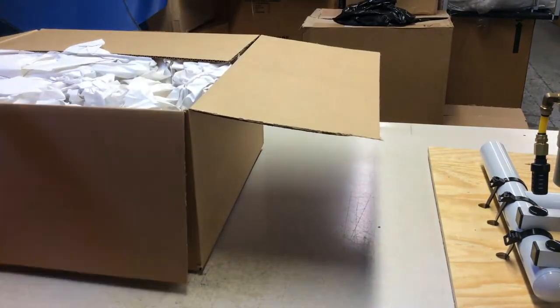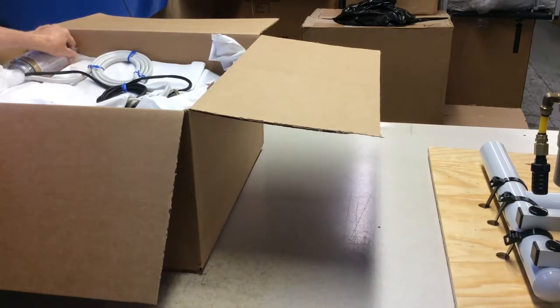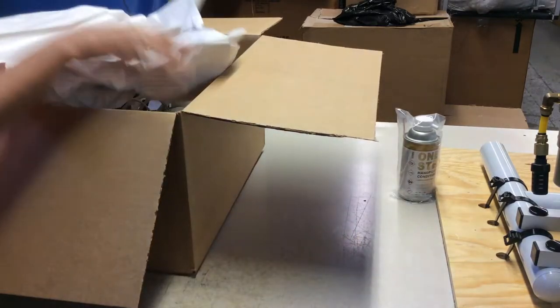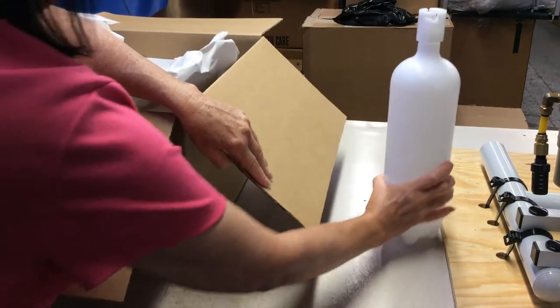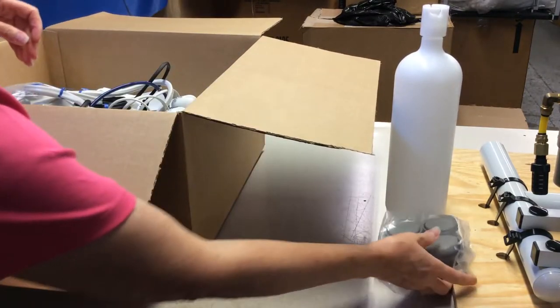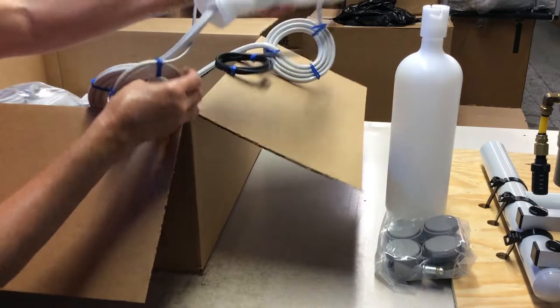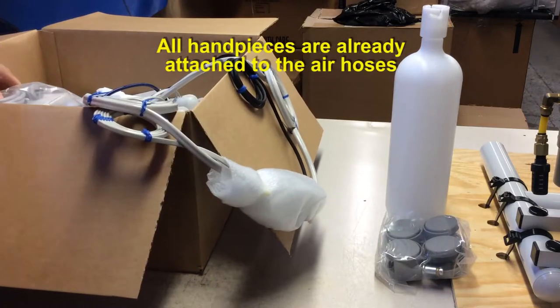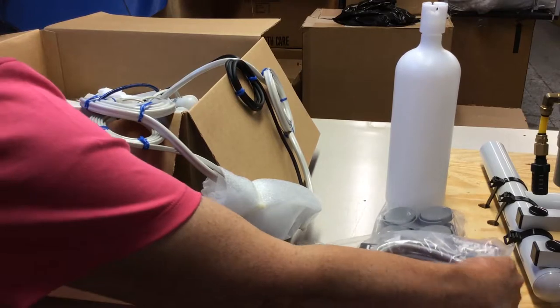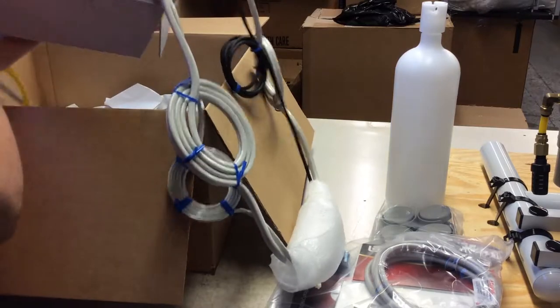Fourth, open the box, remove the packing material, and take out all the individual components. Then carefully remove the module.